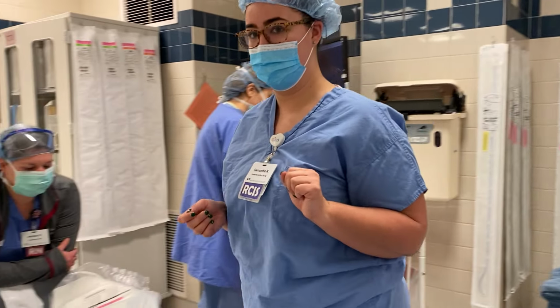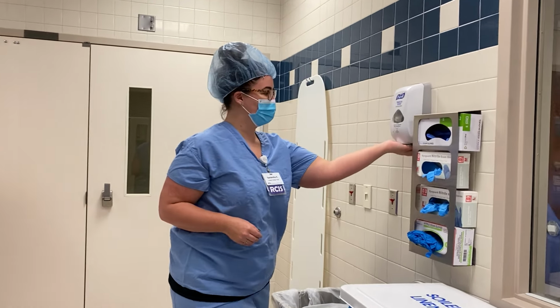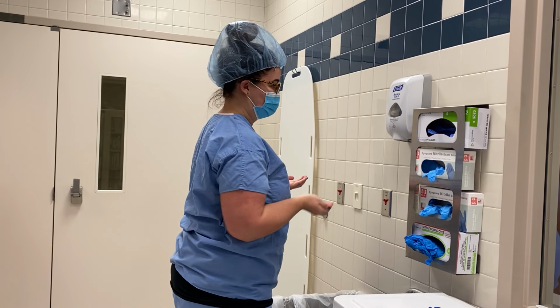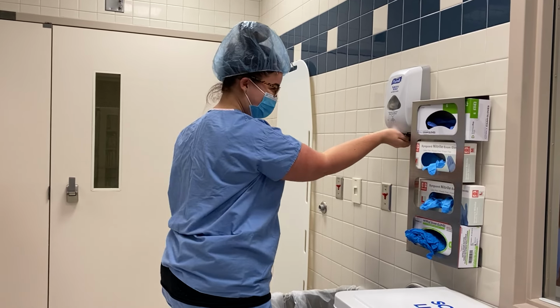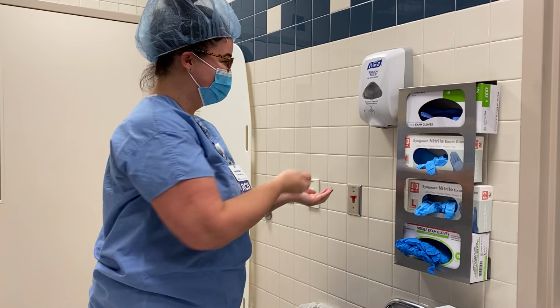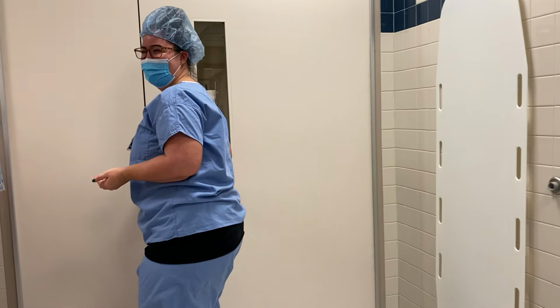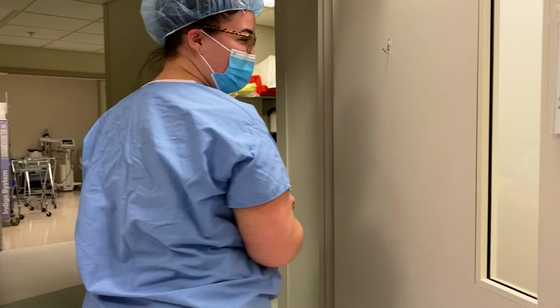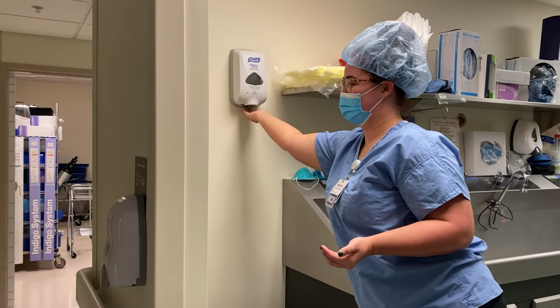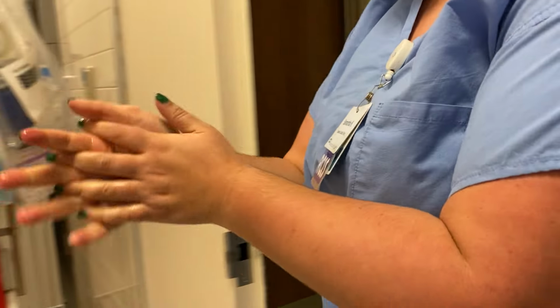So the first thing that I'm gonna need to do is to clean my hands. So I have my gel over here. Well, maybe. That one is finicky. Let's come out here. I have some more out here. So I have gel in both hands, and I'm just going to rub my hands together under my nails.